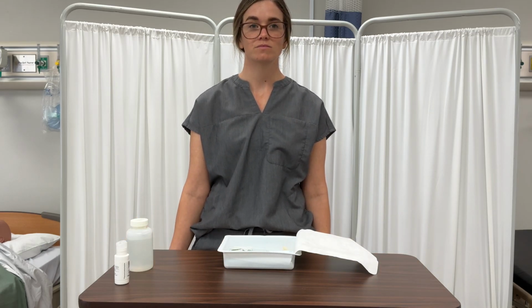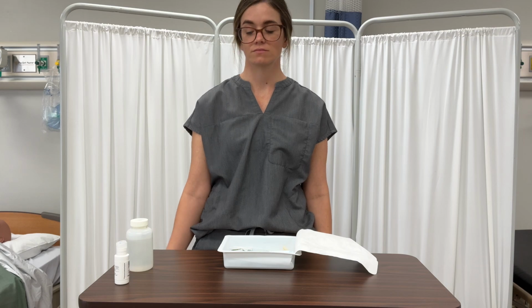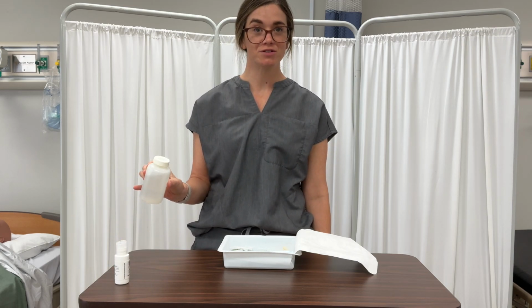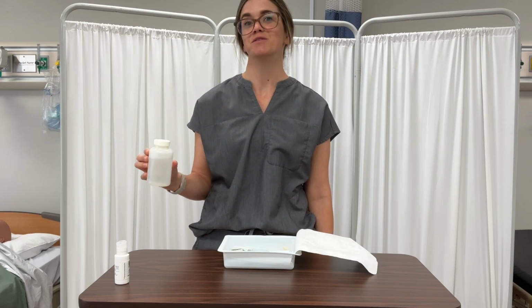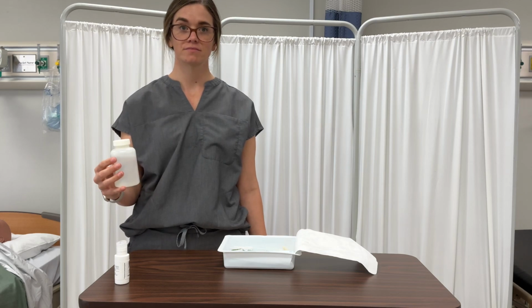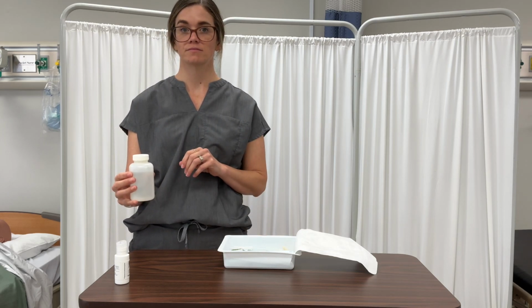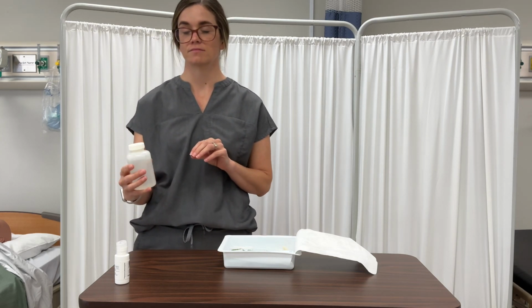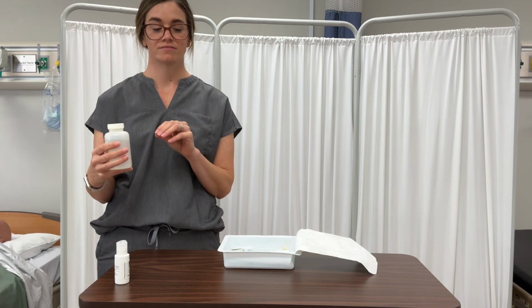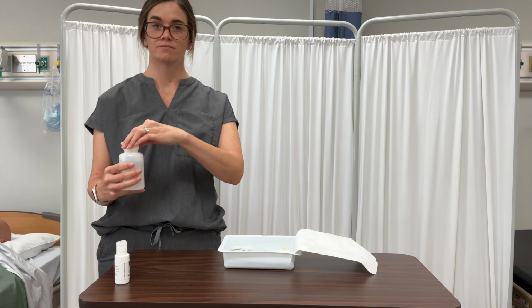Okay, and she's going to verify the contents and expiration date of the solution. If you do get an expired solution, just know that on a person you would not use expired solution. She needs to make sure that she has a receptacle for her solution located near the work surface edge. Okay, and she needs to remove the seal and cap from the bottle in an upward motion.